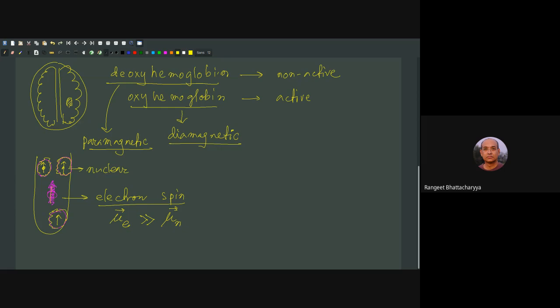The actual details are quite complicated. You have to do a lot of mathematics to find out. But fortunately, they have a very easy to understand effect on the nuclear spin. Imagine all your nucleus spins, just imagine their collective magnetization. When you do nothing, they are along B naught, along the Z direction. We call it magnetization. Magnetization in equilibrium is always along the Z direction.